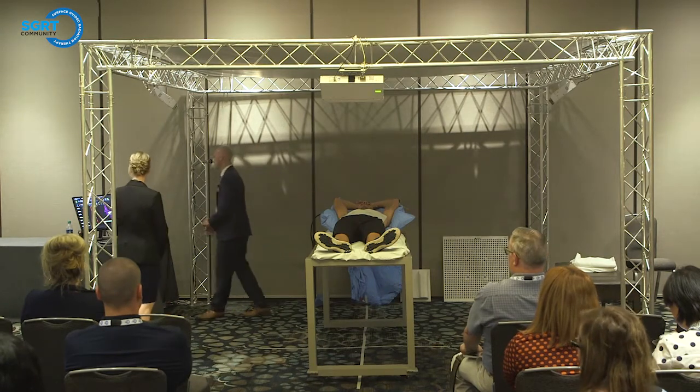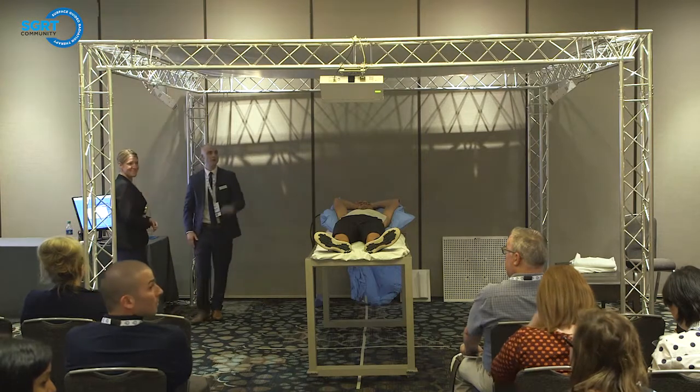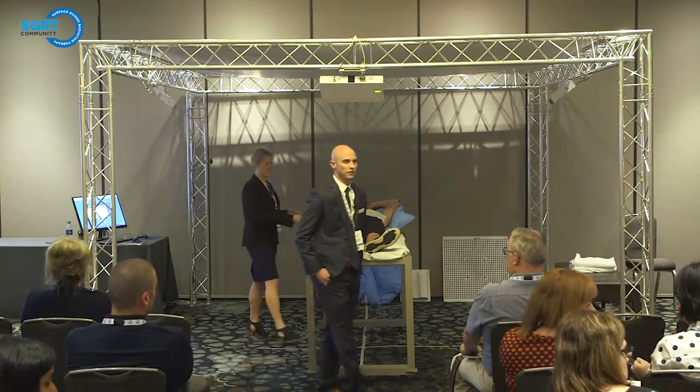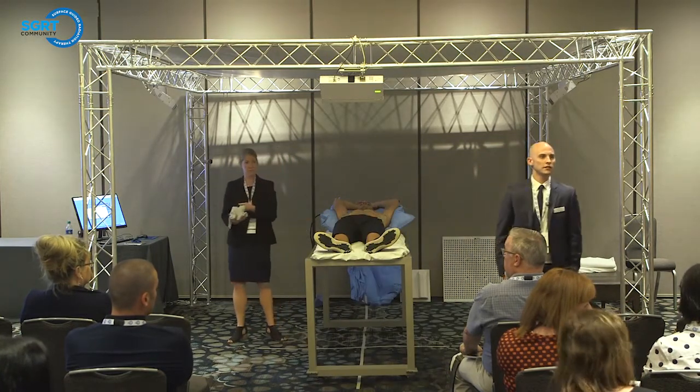Okay, great. Should we move on to DIBH? Okay, let's move on to DIBH really quick. Oh, I'm sorry, is there another question? Yeah, go ahead. With breast patients, is it easier to line them up straight, or with a table rotation, can they go ahead and do it?